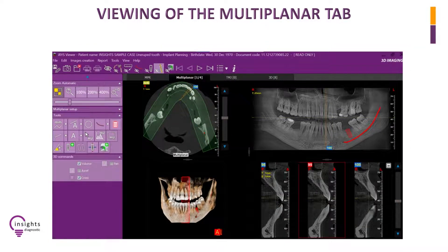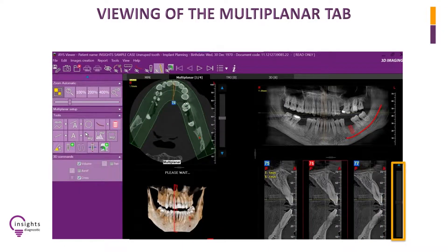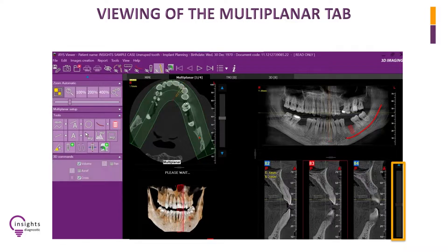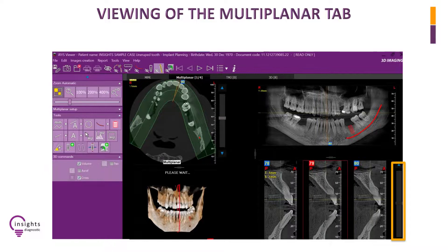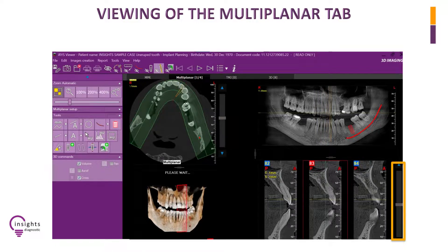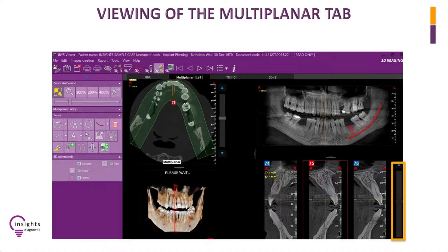Aside from the 3D model, there are other cross-sectional references. The cross-sections are represented by one red and several yellow lines in the axial and panoramic view. Notice that when you slide the navigation bar at the right side of the cross-sectional views, the red and yellow lines follow in the axial and panoramic views. This will allow you to identify which tooth or bone structure is shown in the cross-section.